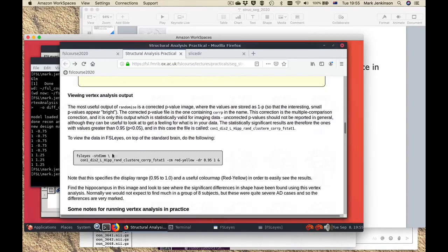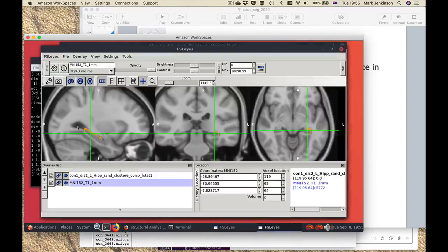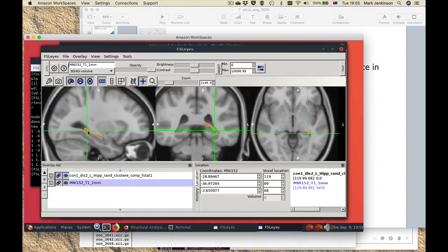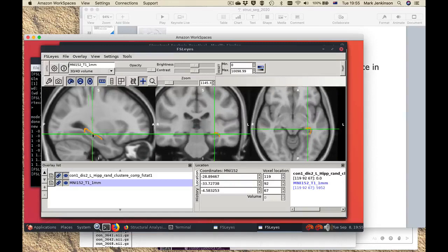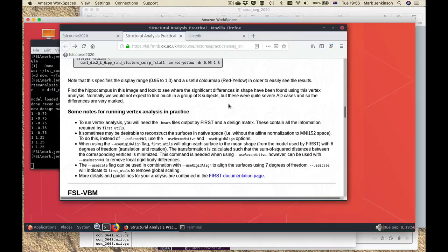The idea here is simply to understand the process of running the shape analysis and then seeing what you get afterwards. Finally there's a command to look at the results, and this is what you would see: it's done in MNI space, so this is the MNI template underneath, and the colored voxels show the parts of the hippocampus which have shown a significant shape change between the two different groups — in this case controls and Alzheimer's patients. That's the section on running FIRST for subcortical segmentation and then looking at vertex analysis.